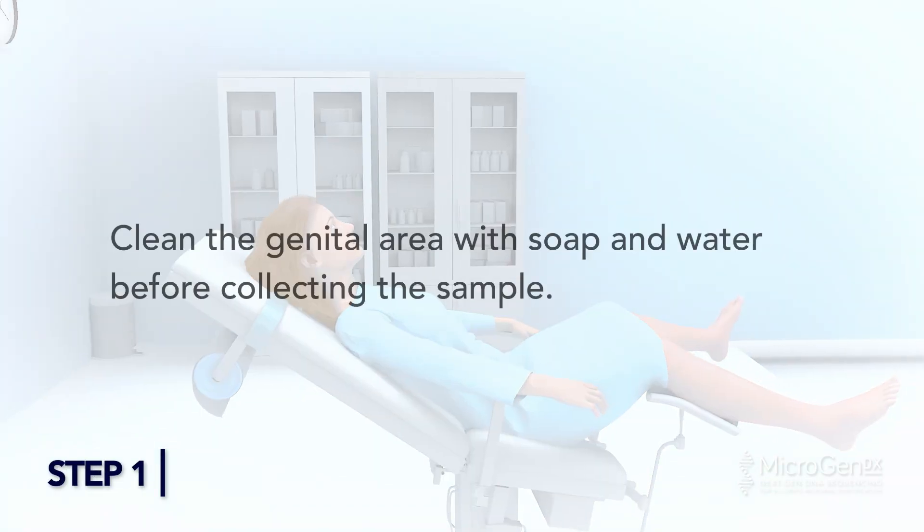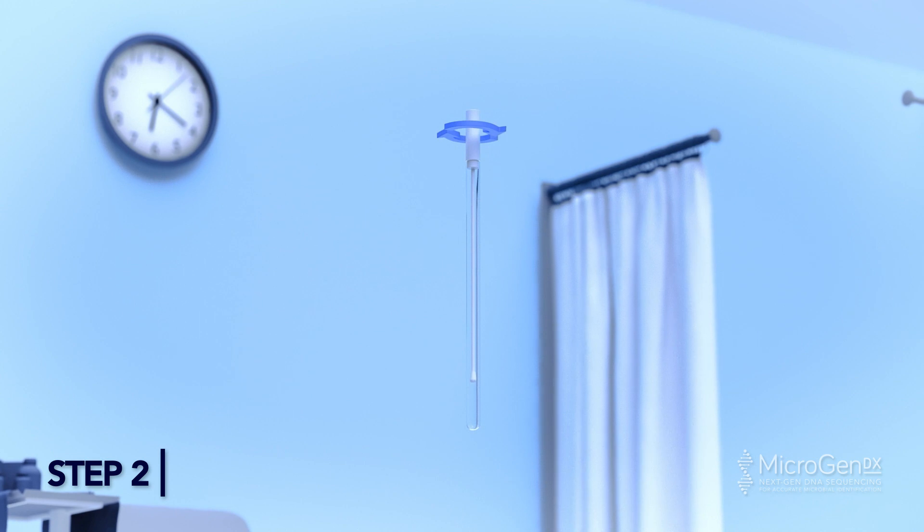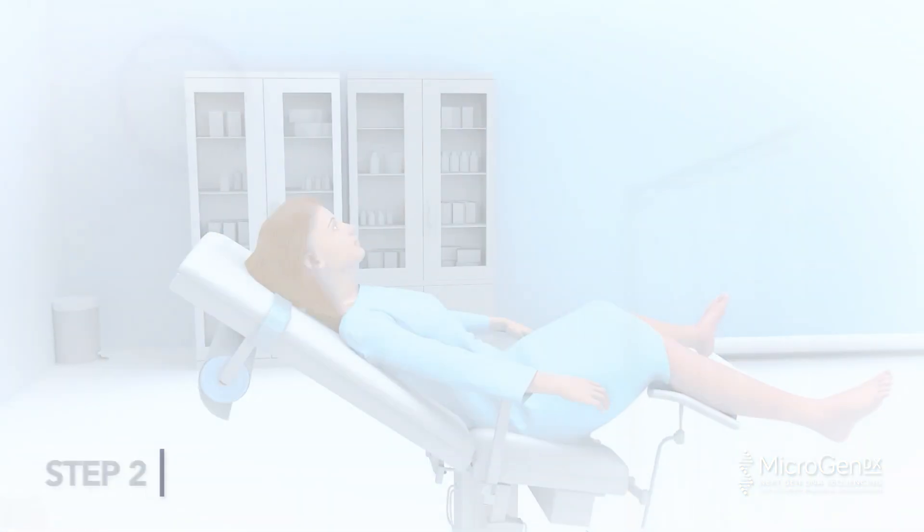Vaginal Collection Step 1: Clean the genital area with soap and water before collecting the sample. Step 2: Twist the cap at the dotted line to break the seal. Remove the swab completely from the tube, not letting your hands touch the swab beyond the break point.